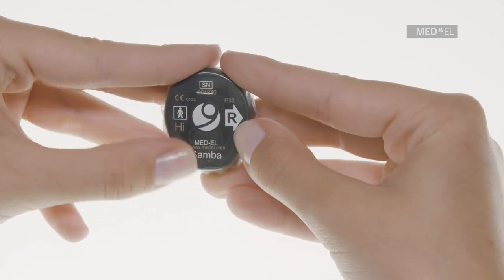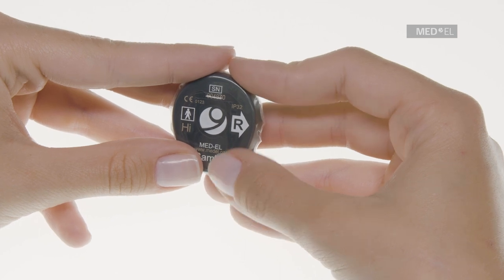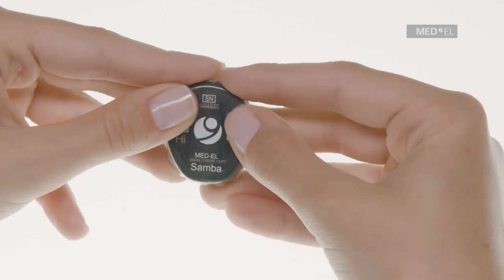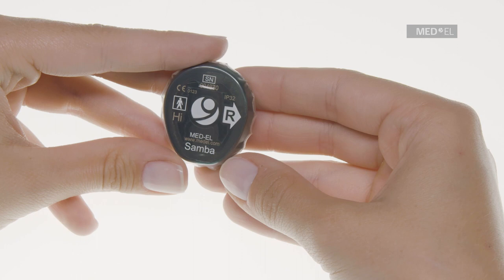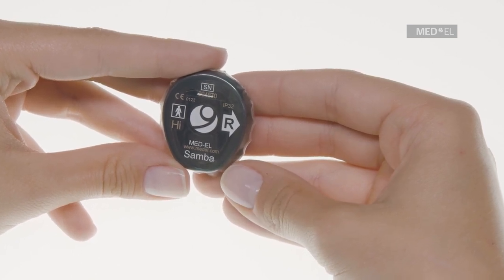Also, ensure that the tape fully covers the rim of the Waterwear skin opening and is not offset or misaligned. Firmly press down along the adhesive section to make sure that Waterwear adheres completely.